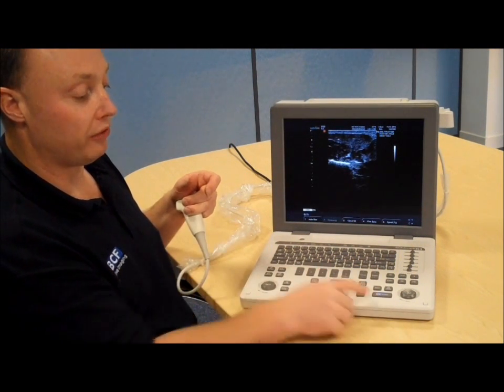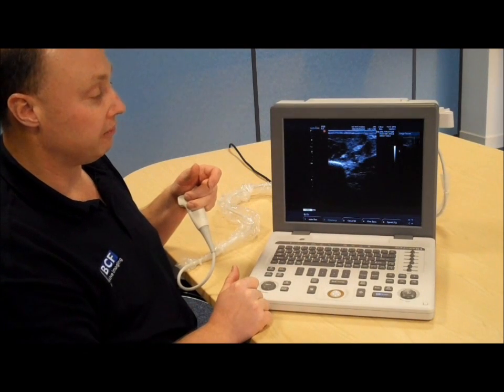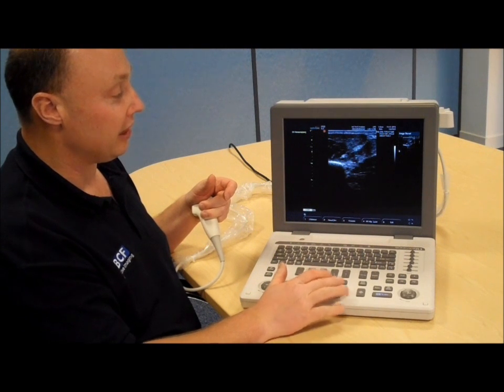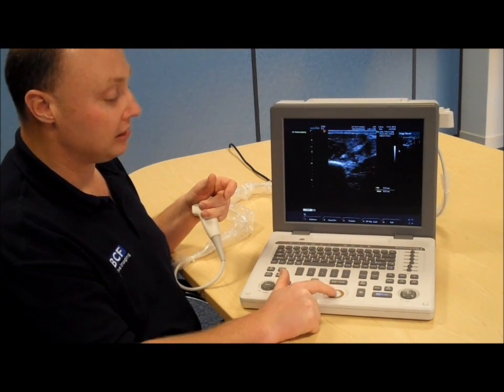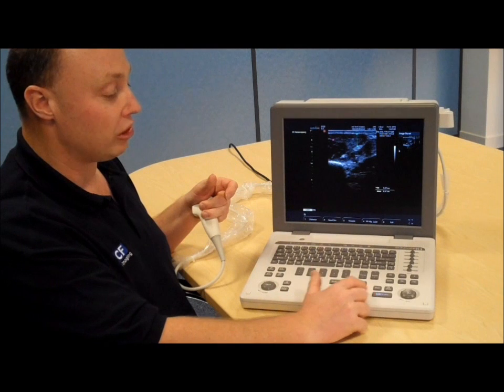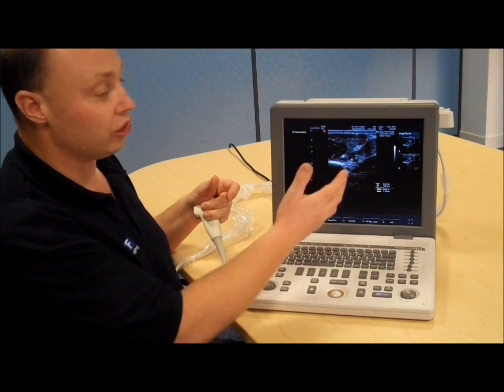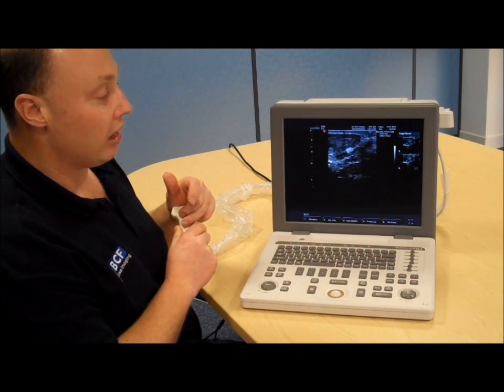At any point you can freeze your image with the freeze button, then use your rollerball to track back through to get to the exact image you wanted to save, and hit the save button — simple as that. You can see it saves a stored image. If you want to do any measurements, hit the caliper button — it brings up a green colored caliper. Move it to the area you want to measure, press set (the button on the right-hand side of the trackpad), move it down to the area of interest, and press set again. Move the other cursor across — it automatically brings up another cursor in an even more distinct color. Once you've done all the measurements, you can save that as an additional image for later review. Then just hit freeze and you can continue to scan the organ of interest.